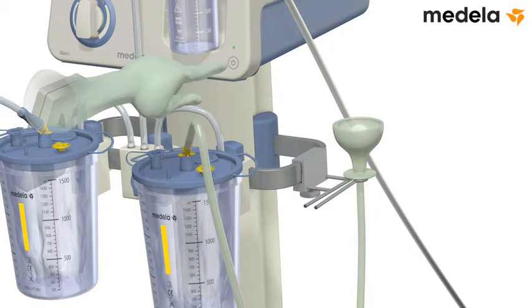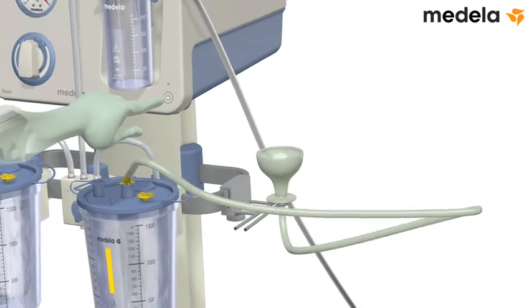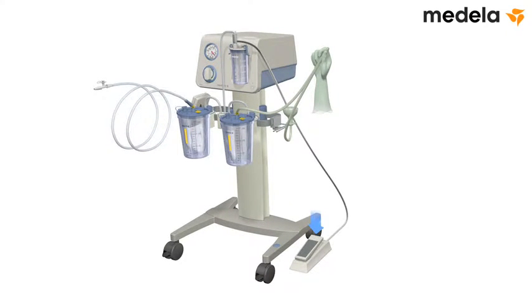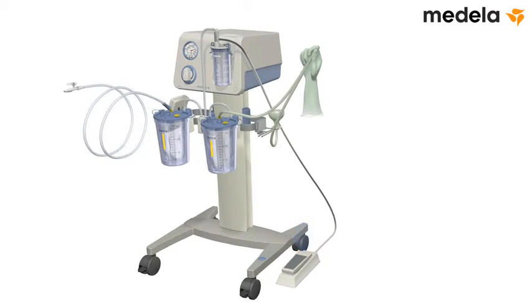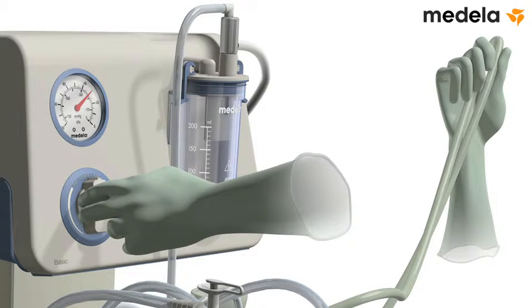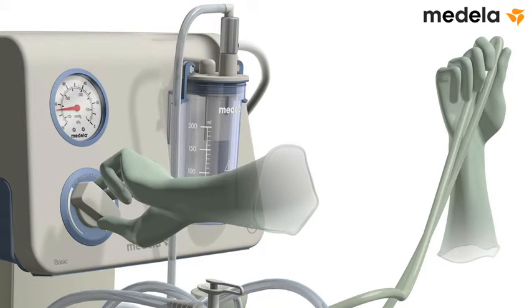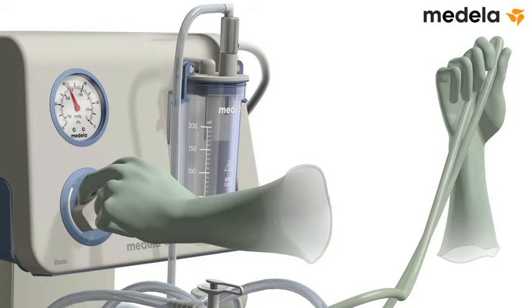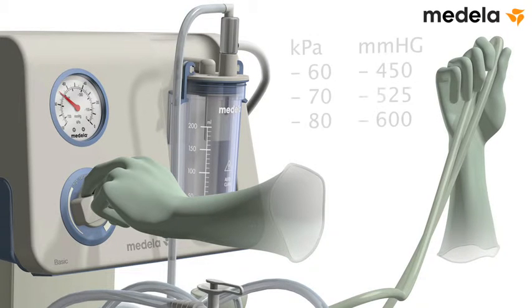To test the vacuum, turn on the pump and clamp the sterile tubing with your thumb and forefinger. Press forward and down using the ball of your foot. Set the pump to the required maximum vacuum. The recommended vacuum level is between minus 60 and minus 80 kilopascal, equivalent to minus 450 and minus 600 millimeters of mercury.